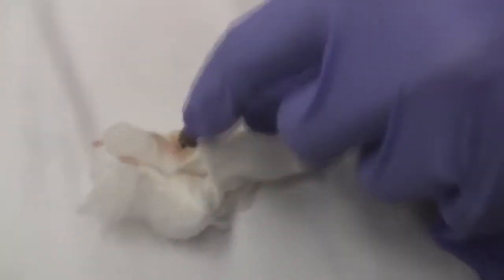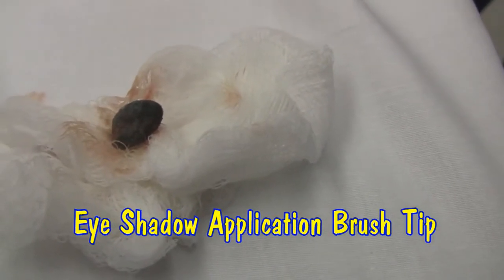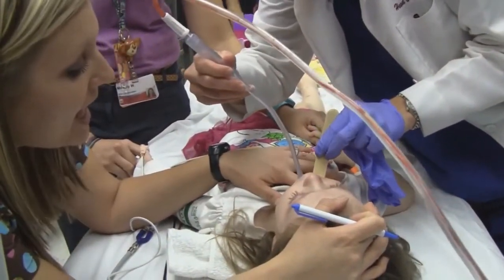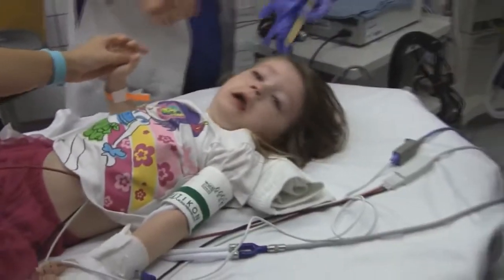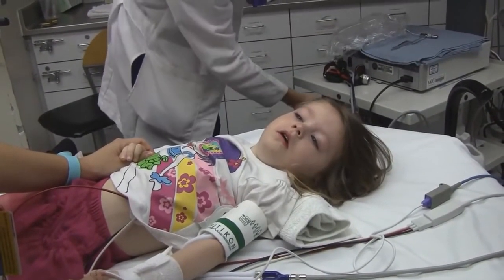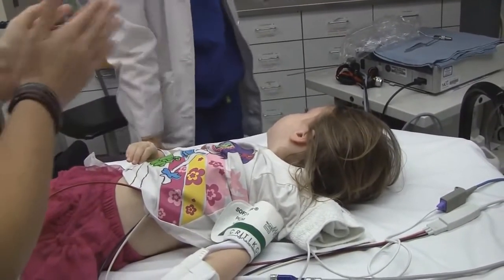Alright, so let's see what the little object was that we had over here. I had a tip of an eye shadow here. I'm just going to suction the back of her throat. She just got a little brush — a little bit of blood. Just like going to the dentist office — say ah. Good job. She woke up at just the right time. The timing was perfect. She's still in La La Land but she's coming around. Alright. All done. Yay. Good job.